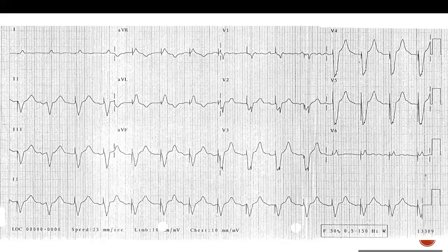There are two components to reading an ECG. The first is the underlying rhythm. You need to see what the atrial beat is, and if you have any ventricular beats, how they look. If there is an AV conduction problem, you need to explain it. Then you go to the pacemaker section. You try to figure out whether it's single or dual, and how the pacemaker is functioning. So there are two components: the regular reading of the ECG and the pacemaker.